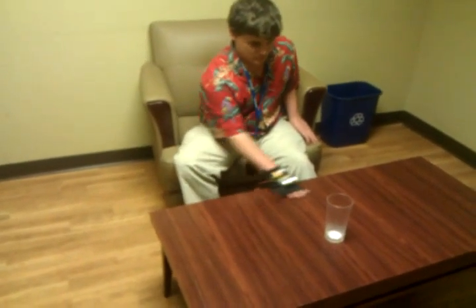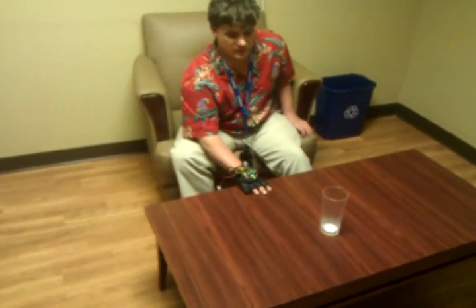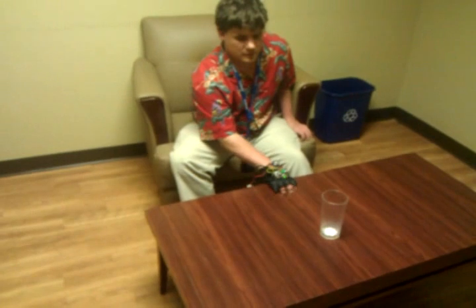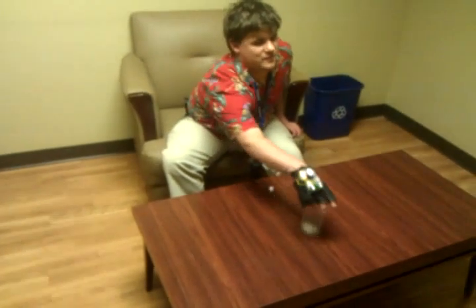I put on the table in front of you a glass. Can you go ahead and locate that using the bat? Yes, I'll do that. Okay, fantastic.